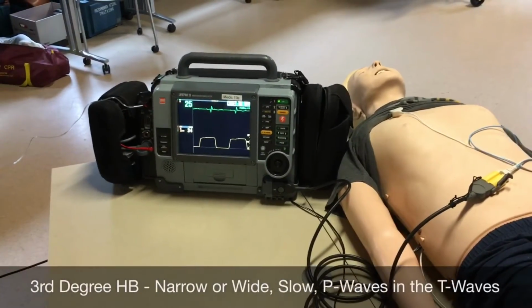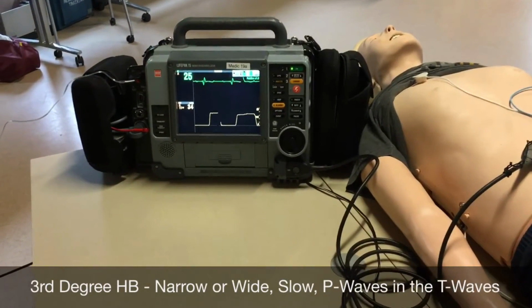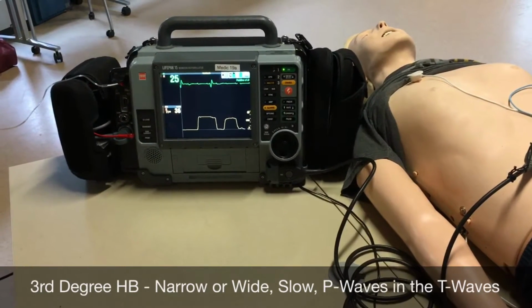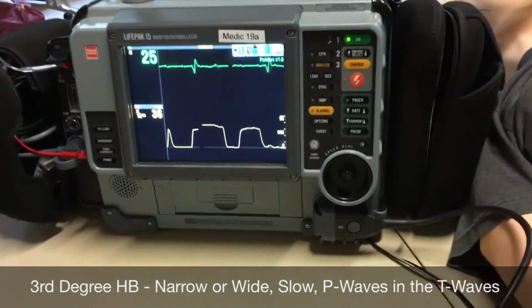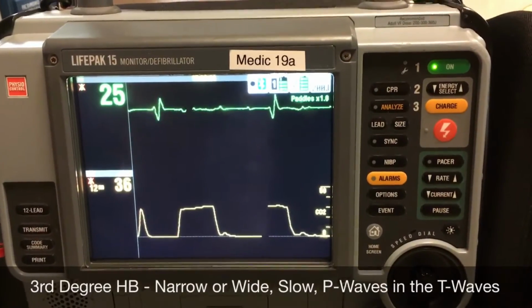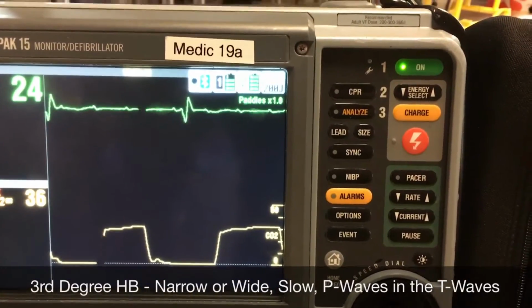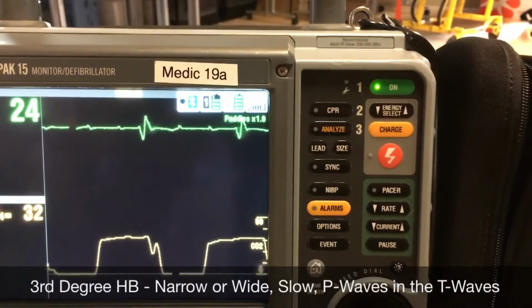So the first thing we're going to talk about is rhythm recognition of third degree heart block. And as we all know, that means that P waves are independent of QRSs. The easiest way to find that out is to look for P waves in the T waves. So we know that third degree heart block can be narrow or wide depending on where it is in the AV junction, above or below, but more importantly, nothing should ever drop in the area of repolarization, the area of the ST segment, unless there's dissociation.